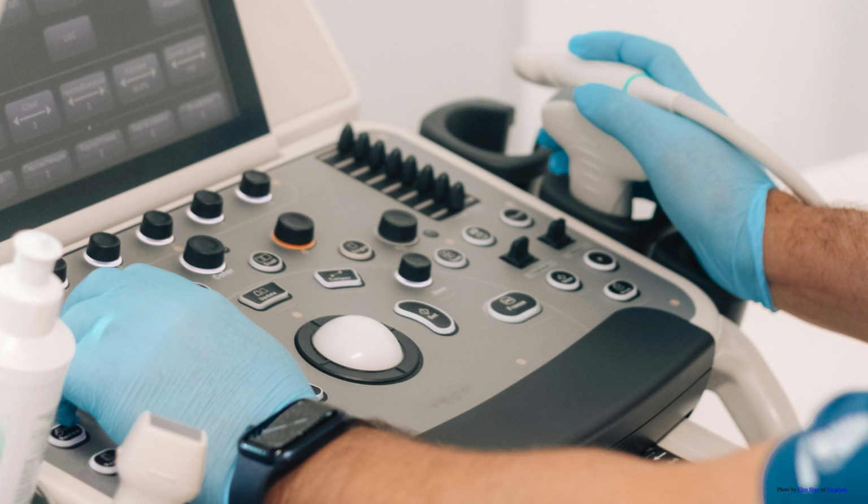So we can do this very ubiquitously in our patient population to screen who has cholelithiasis, who might have cholecystitis, and start narrowing into the population where we need to keep searching for other medical causes, or where we have something that may need the attention of a surgeon right now. So ultrasound is the mainstay of our diagnosis and where we're going to spend our time.